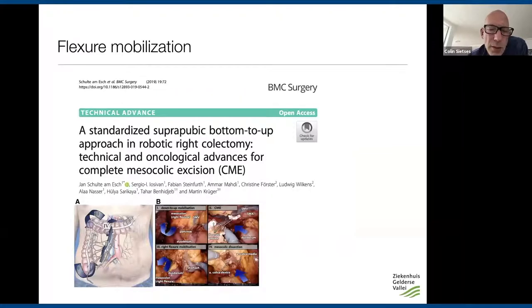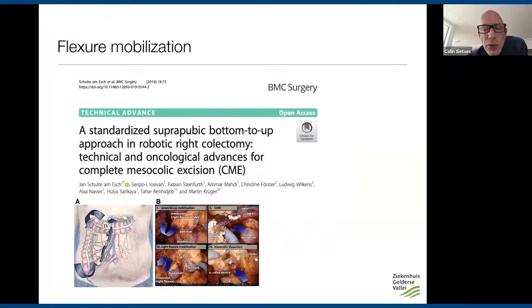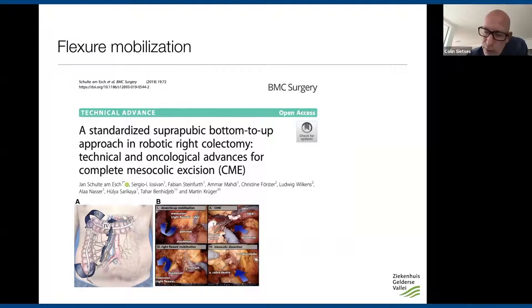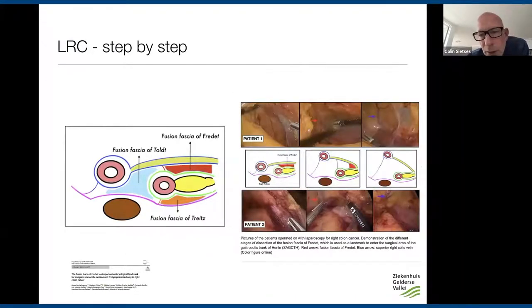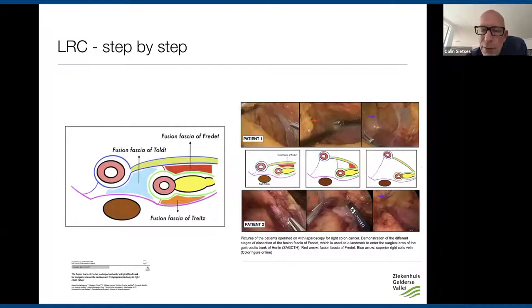For hepatic flexure mobilization, rather than approaching from above over the transverse colon, I prefer making a tunnel from below — the same bottom-to-up approach as in right colectomy. Following the plane behind Toldt's fusion fascia all the way up to the transverse colon, then cutting the adhesions between the duodenum and the mesentery of the transverse colon, freeing it completely from the duodenum and pancreas. Once everything is freed from below, it is relatively easy to mobilize the rest from lateral and from above.